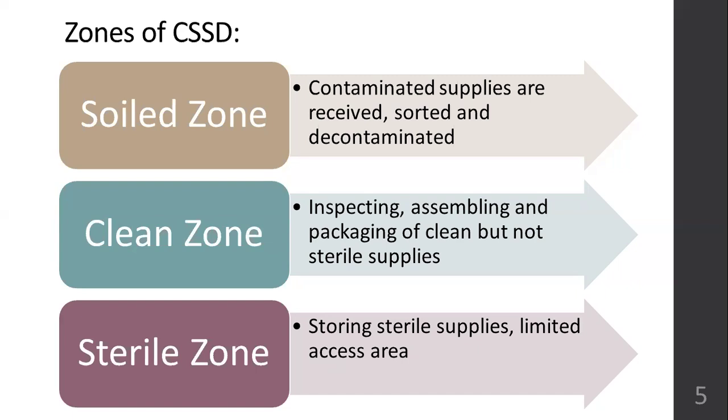Okay. And after the sterilization is done, after the processing is done, you will keep the article in the sterile zone. Here storing will be done. Okay. Limited access area. Only the staff who are supposed to enter the sterile zone, only they are allowed to enter. Okay.